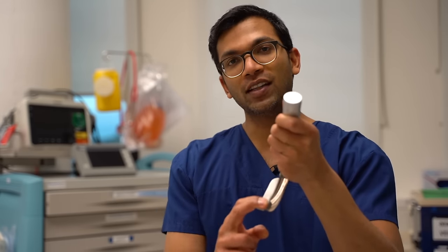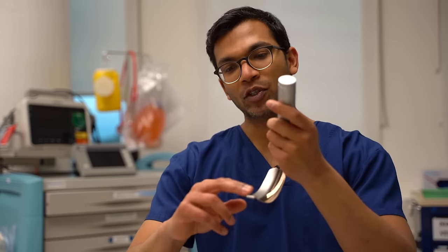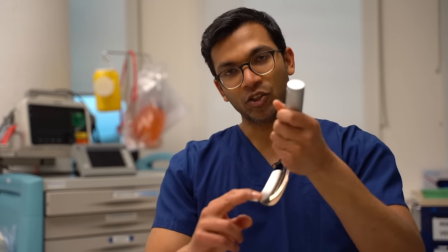The size 3 blade has one advantage in my eyes. Next time you're in theatre, try this: get someone to press down on the tip of the blade and you'll find it's far easier to lift the size 3 up than the size 4. The size 4 blade has a much larger lever, which means that if someone's pressing down and you're trying to lift, it's far harder to do.